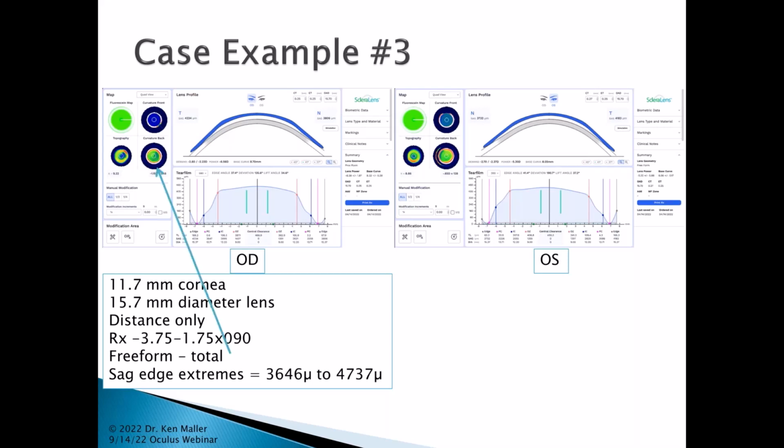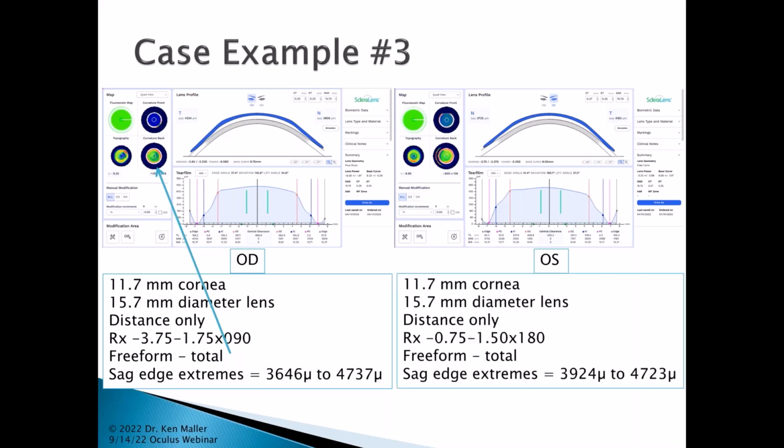You'll notice that the graphic on the back curvature there in the center is not that solid green anymore, but it's sort of green on one half and dark green on the other. There's a little blip down in the inferior portion, and that's because this lens really is a totally freeform design lens, and that darker blip centrally really has to do with where that nodule was, because that's how I was addressing that better to get this lens to negotiate over that nodule.